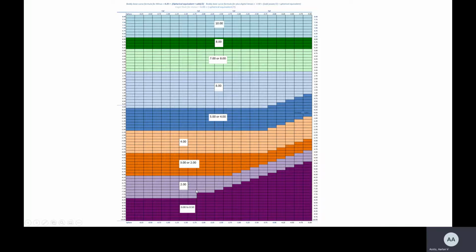Now, ideally, I would imagine that if you did any calculations out, it wouldn't be a 2 or a plano, it would be somewhere in between, but they had to round to the closest one, which is why ideally this almost may be like minus a plano, quarter, a half, 75, 125, 150, all the way up, and you keep going.